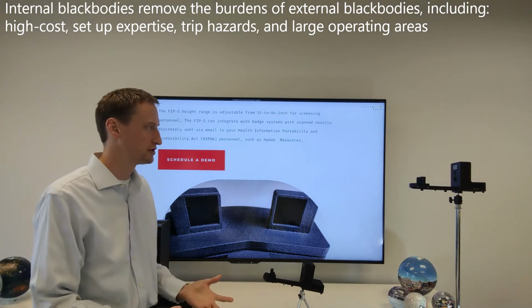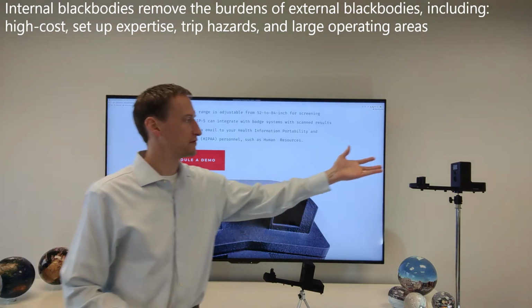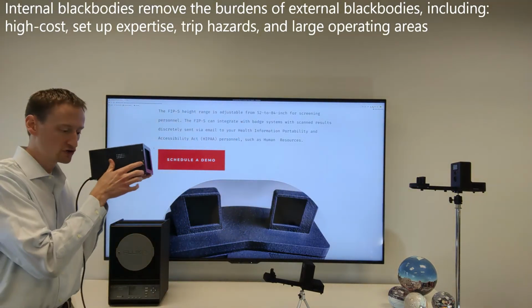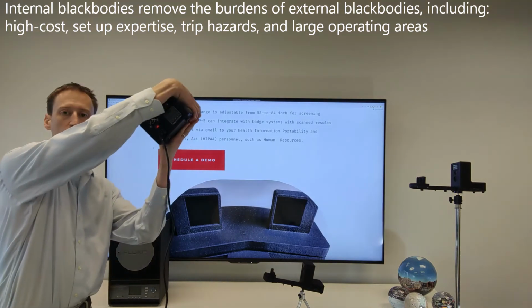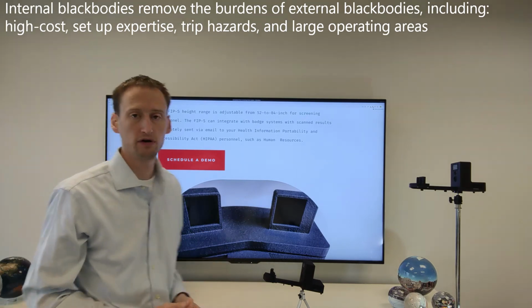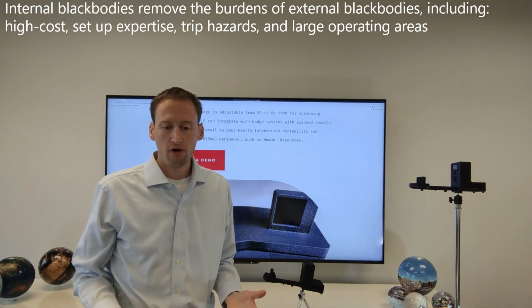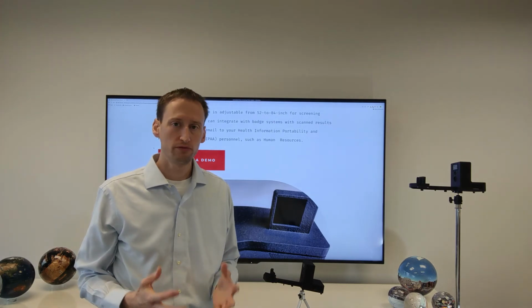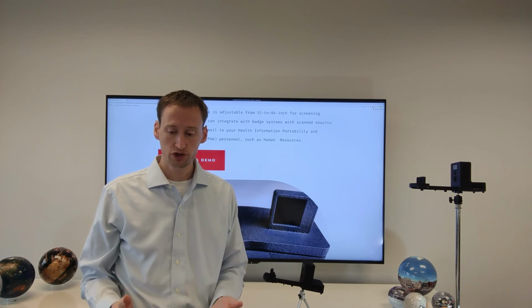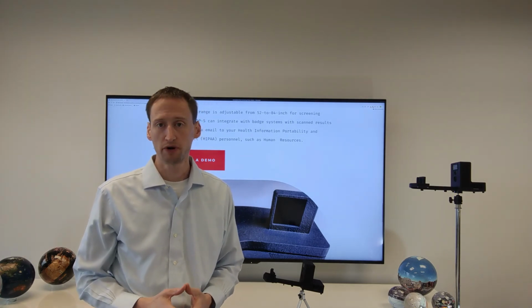Now, if you can envision your scenario, you'll have an area with lots of traffic walking through. You'll have to have the thermal imaging camera at one end and the black body at the other end. You'll have a tripod underneath it, a cord running underneath it, and you have to make sure that no one trips over it or knocks it out of the field of view or out of the measurement zone within the image. All in all, it puts a tremendous burden on you, the operator, to ensure that it's operating just right, or you're not going to get the safety you were promised.